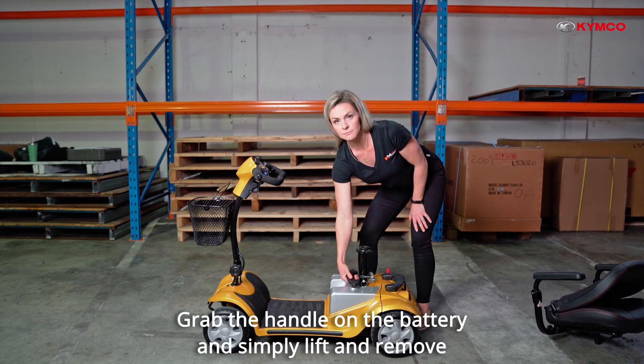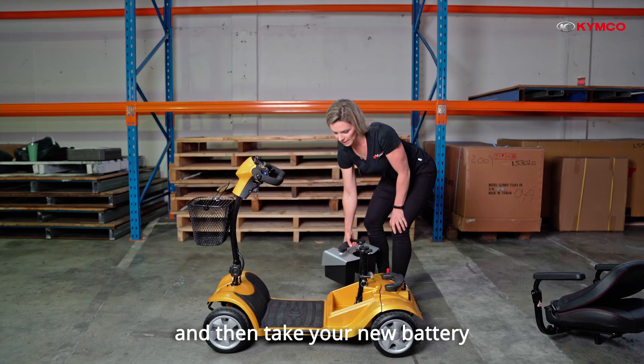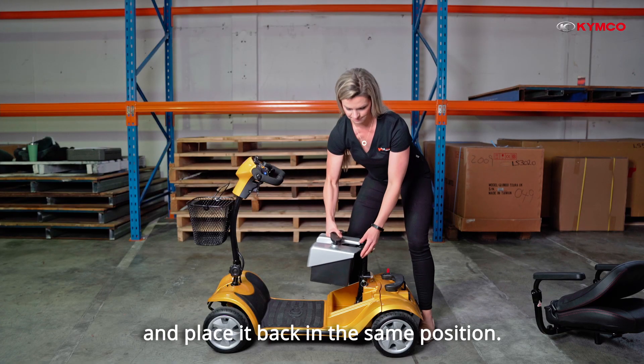Grab the handle on the battery and simply lift and remove it. Then take your new battery and place it back in the same position.